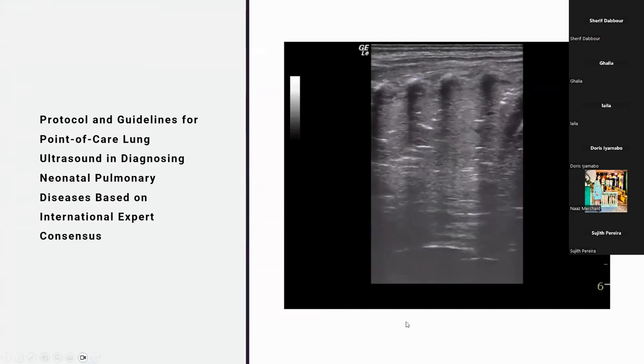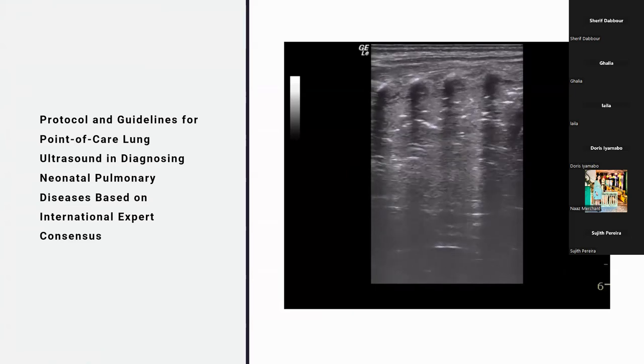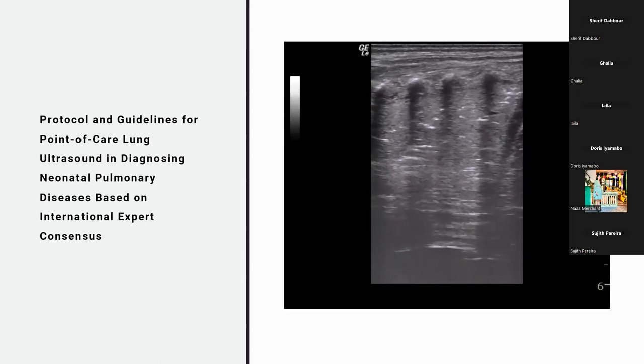Yes. So just, can I just say that there is no single sign whose presence or absence confidently differentiates collapse from consolidation, from pneumonic consolidation, from atelectasis. This is pure experience. And what I would say is that in addition to pattern recognition, your clinical history is very important. If you have compressive atelectasis, obviously if the baby's deteriorating, you might need to go up onto ventilation. But really, you'll need to drain that in order to improve that lung recruitment.